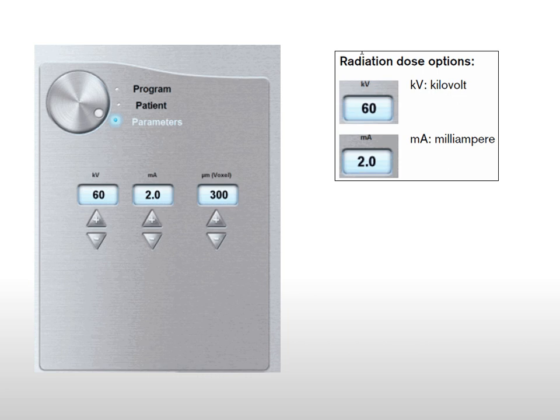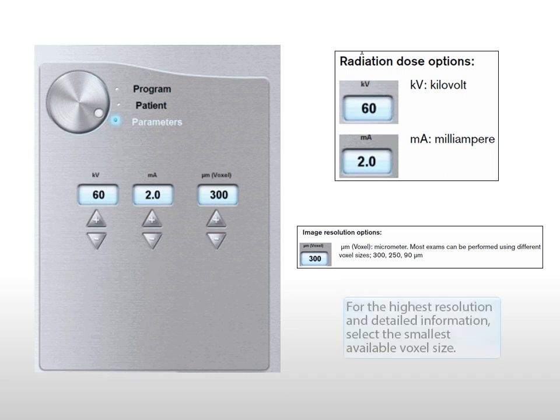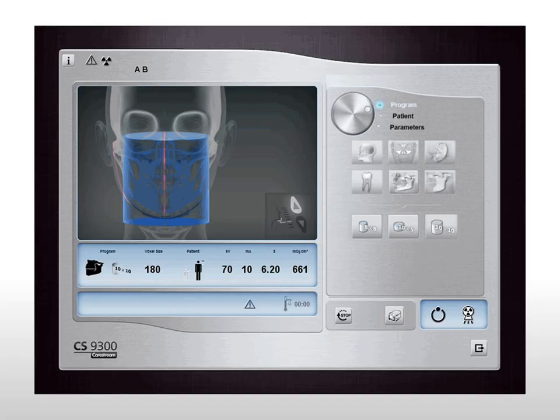If the default parameter settings for KV and MA are not adapted to your patient type, select the appropriate KV and MA parameters. If the default voxel parameter setting is not the image resolution you want, select the appropriate voxel parameter. For the highest resolution and detailed information, select the smallest available voxel size. For the lowest resolution and less detailed information, select the largest available voxel size.